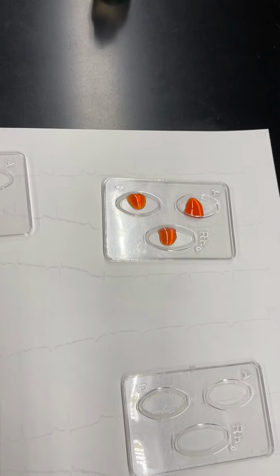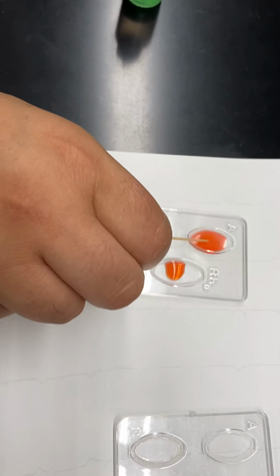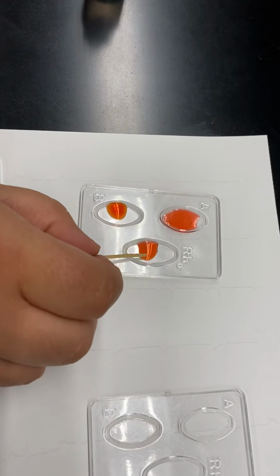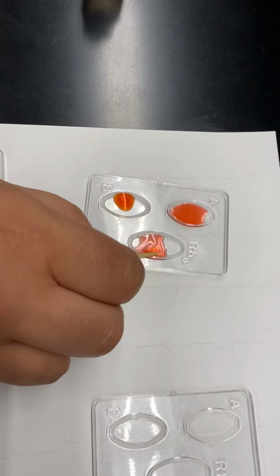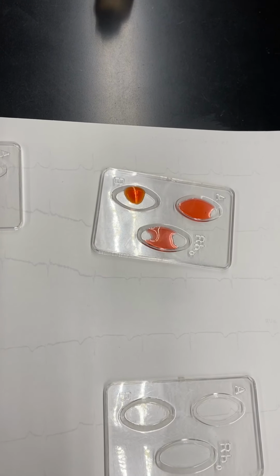Understand that when I'm mixing the sample, you don't wanna cross-contaminate. So if I'm using my toothpick to mix this sample right here, I don't want to transfer this to the other sample. So I'm going to use a different toothpick and mix the other sample. And again, repeat it for my B portion.